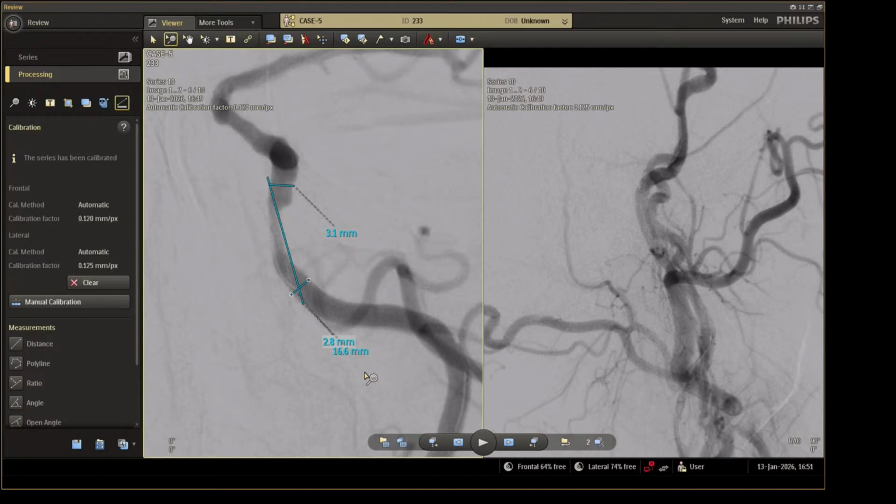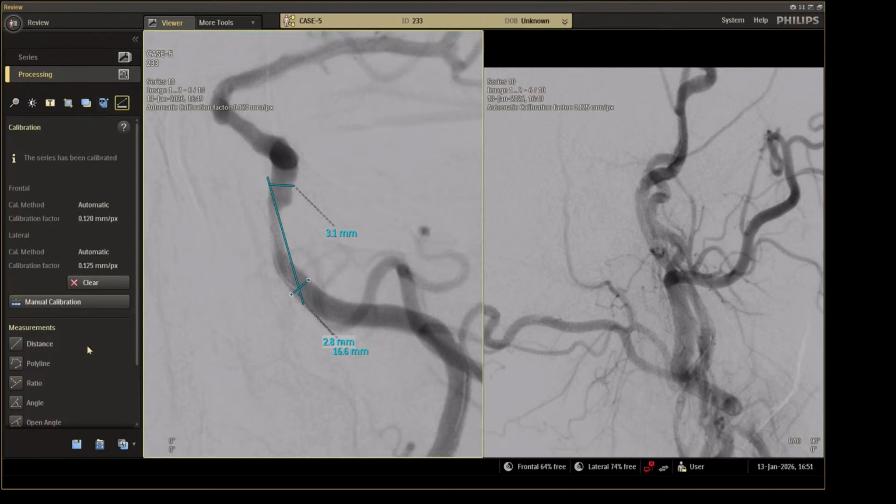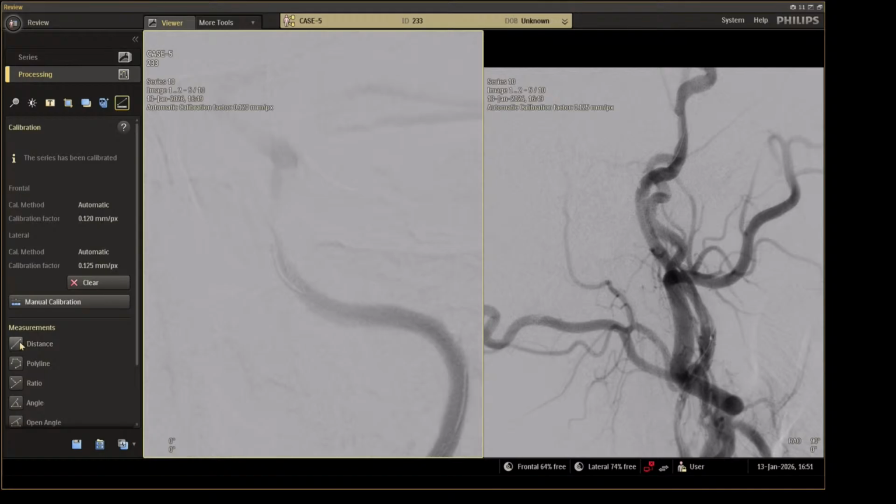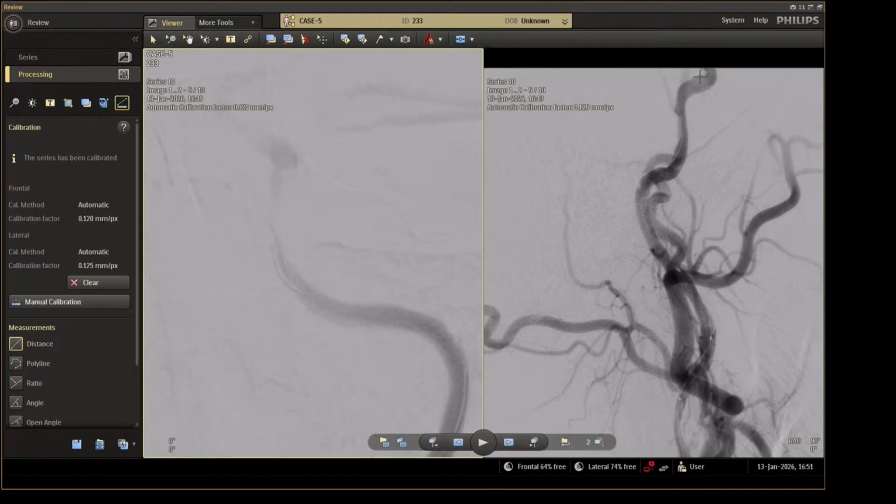3 millimeter Nagomi, I think it will be okay. Yes, it should be. Okay, let's check this part also. It should be 3 something. Yes, 3 millimeter should be okay.